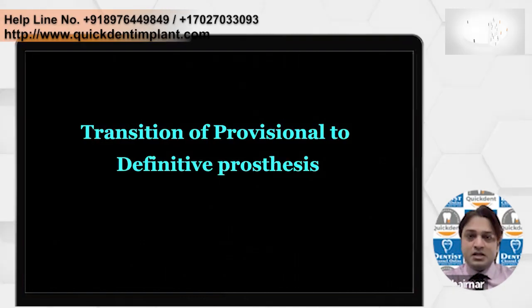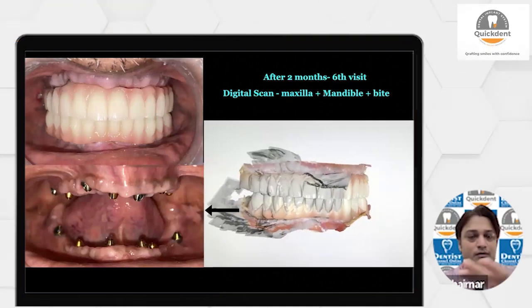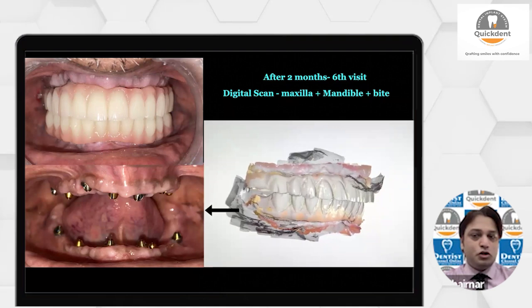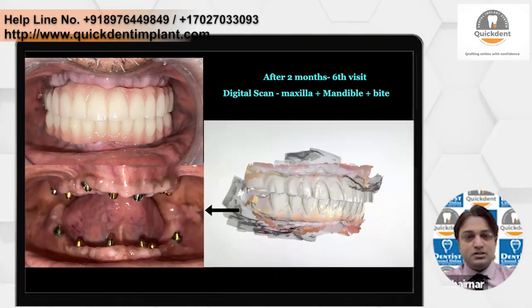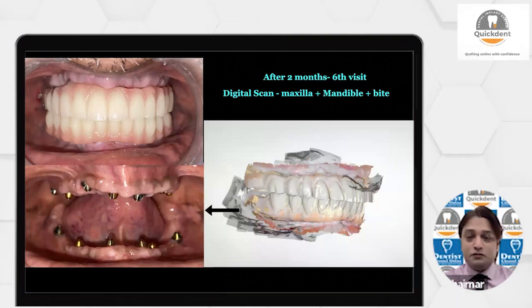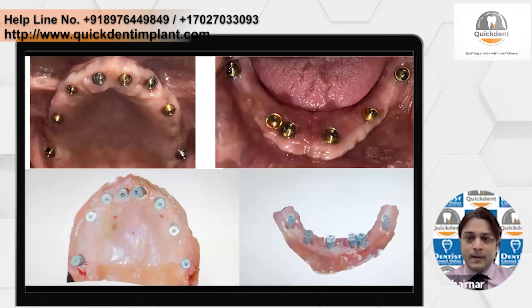Now, how do we change it? The patient comes with shrinkage of the gums. In the same way, we record the upper and lower jaw, scan and bite. Also, after retrieving the prosthesis, we record the position of the multi-unit and the new position of the gums, the healed areas. Everything is recorded.